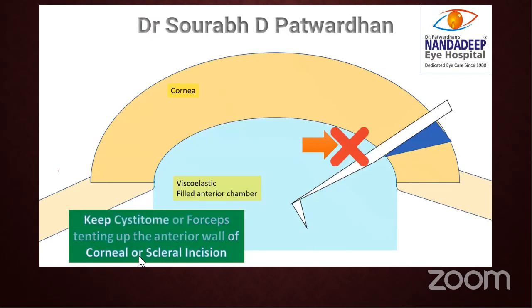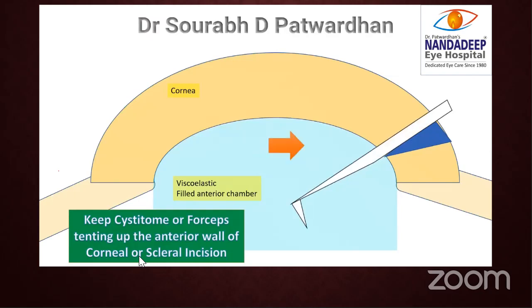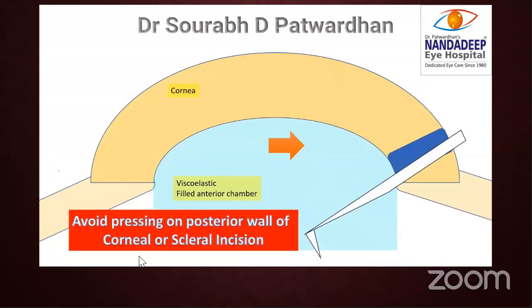So whenever you are using any instrument from the main incision, if you want to keep the anterior chamber stable, you have to always tent up the instruments, always. So irrespective of whether you are maneuvering away from the incision or in the sub-incisional area, you have to keep tenting up the instruments. You have to keep reminding yourself when you are operating. Because the moment you press the posterior lip down, you are going to break this seal of the incision and the visco or fluid is going to come out.